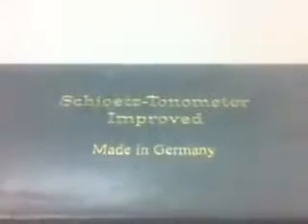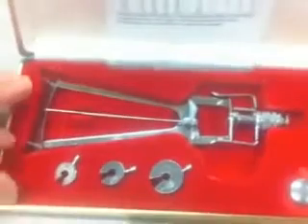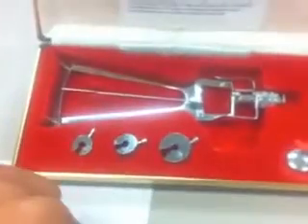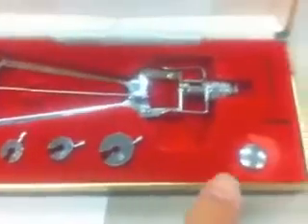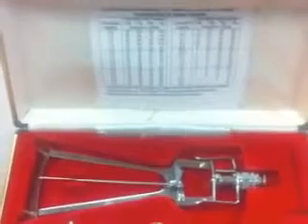This is the Schiotz tonometer. This particular model is improved and made in Germany. If we look inside, you have the Schiotz tonometer itself with various weights, 7.5, 10, and 15 grams. And inside the case, we also find the conversion table for the tonometer.